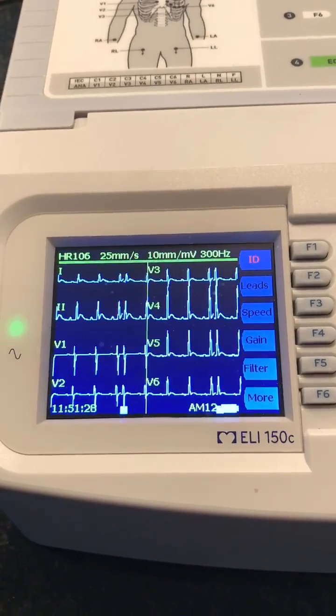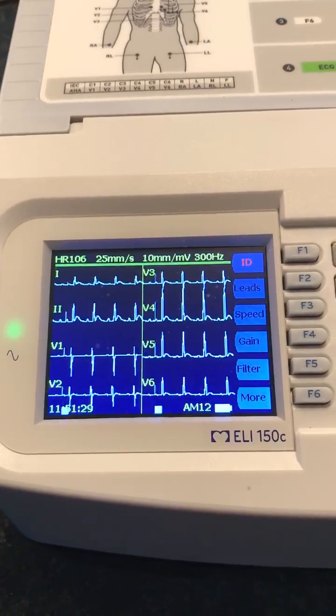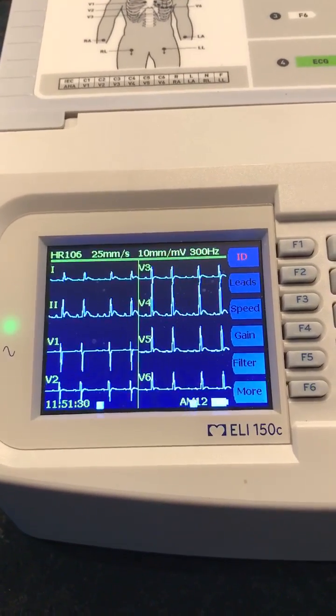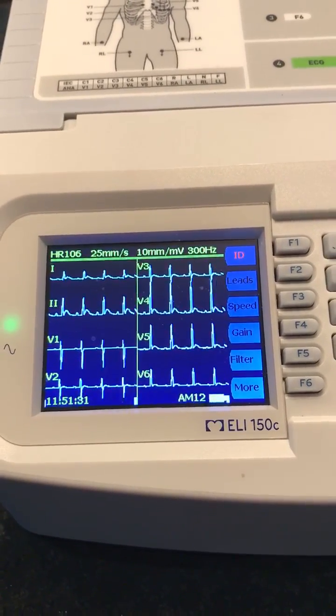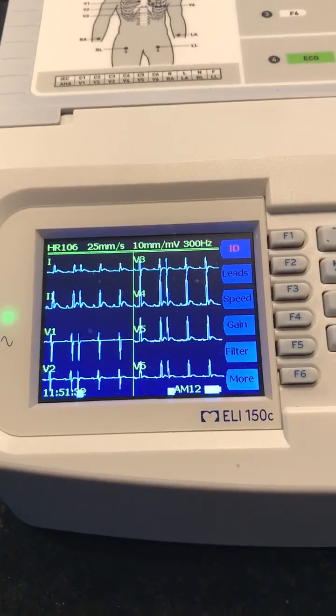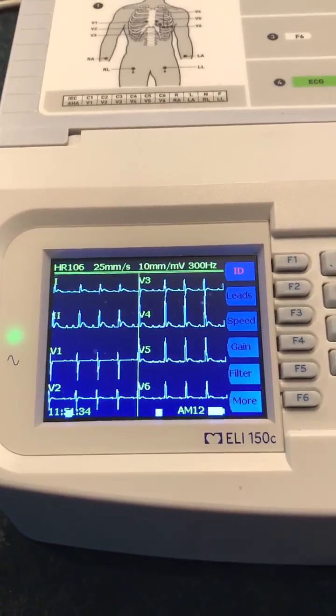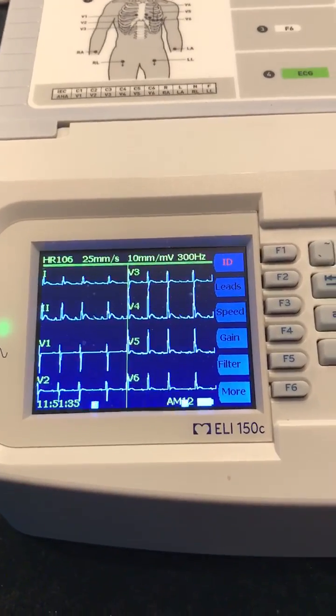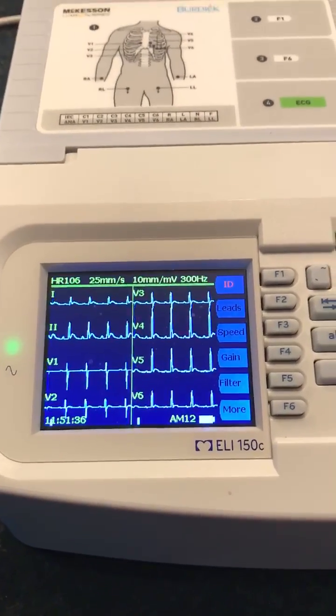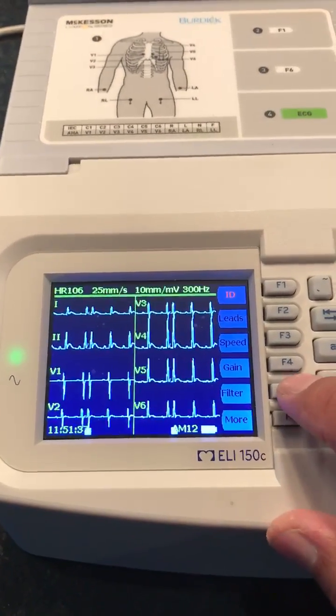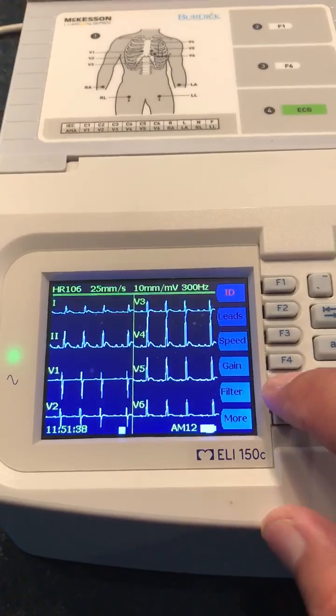Hey guys, Dirk again. Paige also asked me to do a video on how to get to the settings. When you have the unit turned on, we go over here and hit F5.